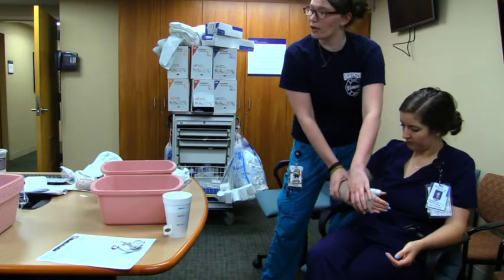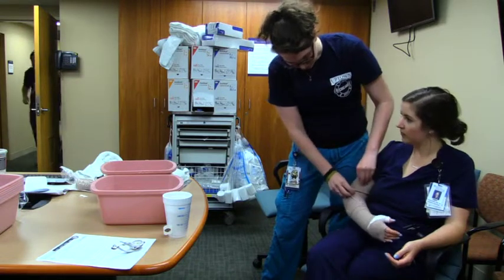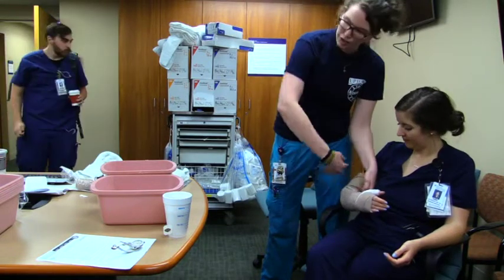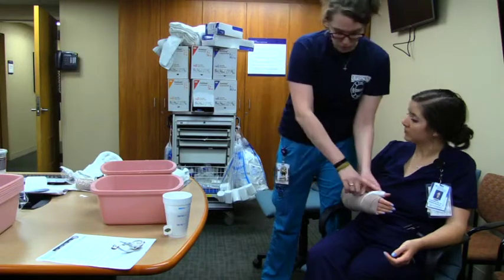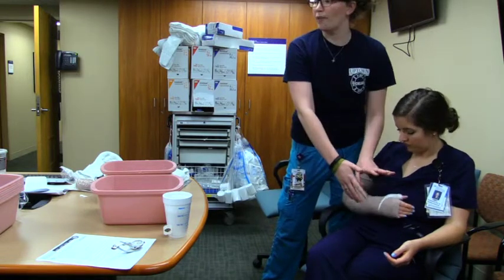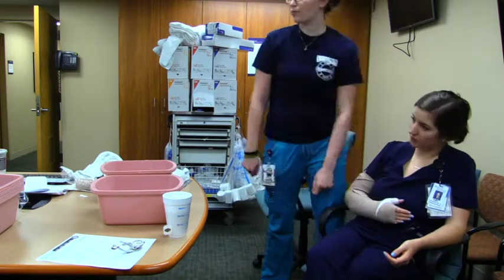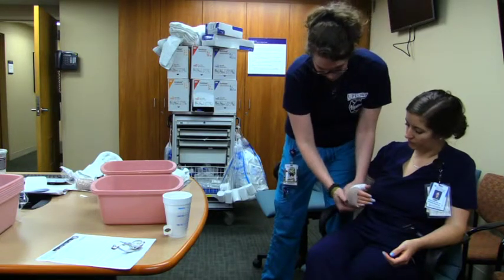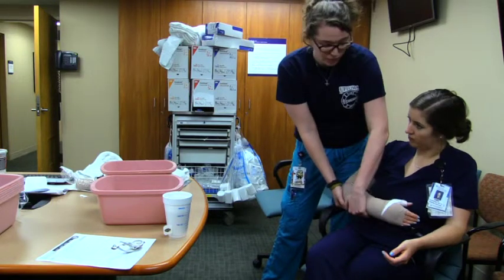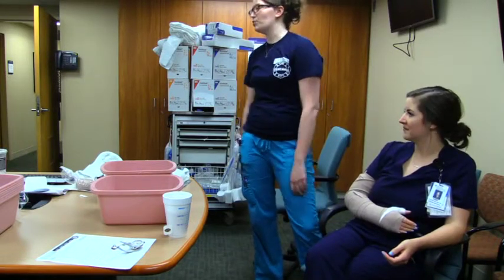If you notice, I use the smaller ace wrap up by the hand just because you want to avoid wrinkles. You use the smaller up by the hand and then get a larger size for up here. Normally this would not be showing — what you should see is just ace wrap with a little bit of stockinette peeking out at both sides, and then you would fold that over. Then to complete it, you would just sit there and mold it in the position you want it — 90 degrees, position of comfort — until it hardens. Set them up with a sling and that is your long arm posterior splint.